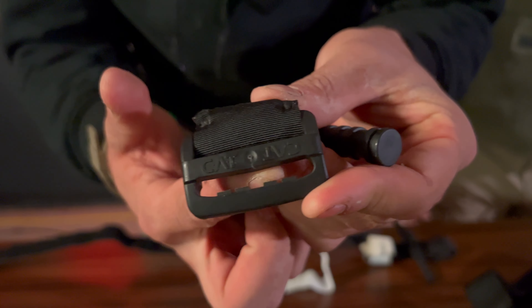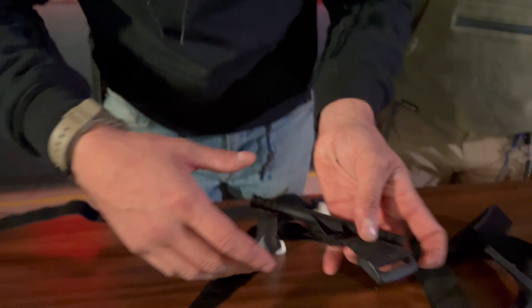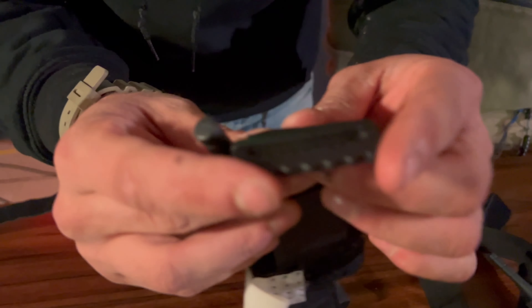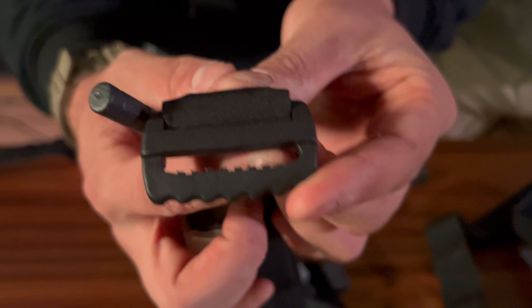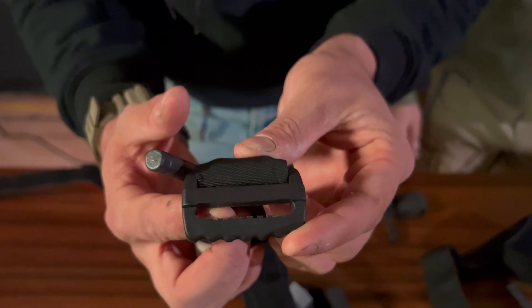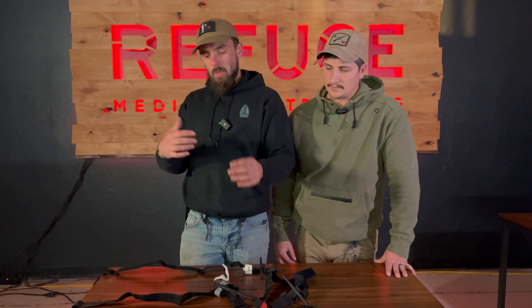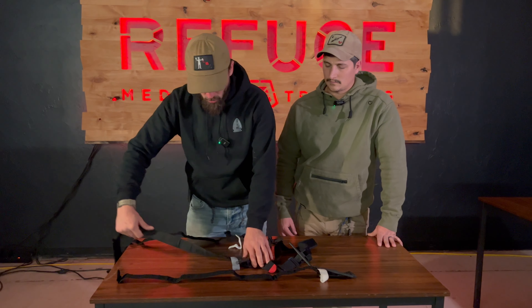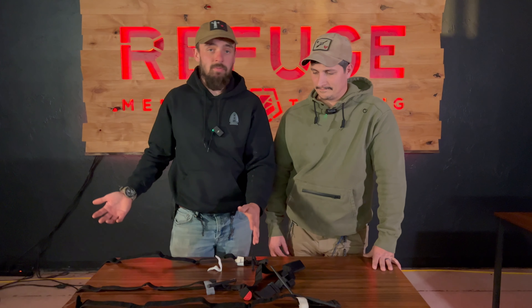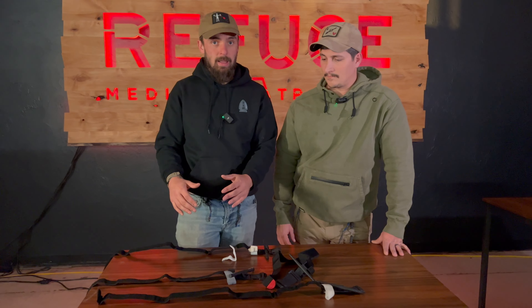Let's look at the buckle, because the buckle is important. On the genuine CAT buckle, it has 'CAT' stamped right there as well as four little teeth on the bottom. Those four teeth allow you to grab onto the tourniquet properly. On the fake we have a bunch of little ridges instead — that's not going to have the same bite as four large teeth on an actual genuine CAT tourniquet.